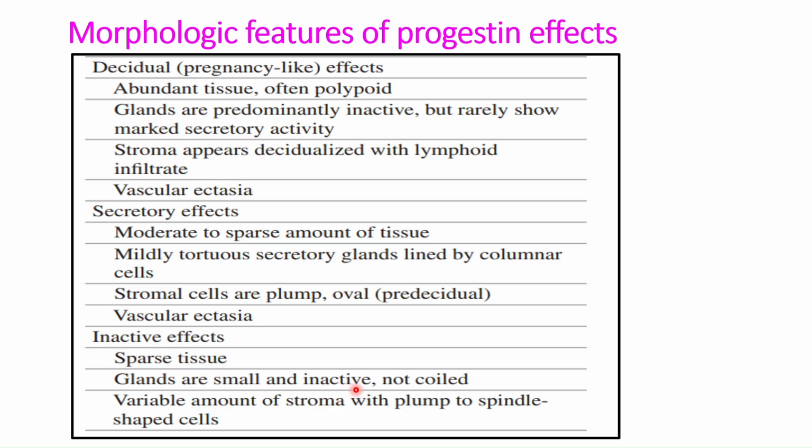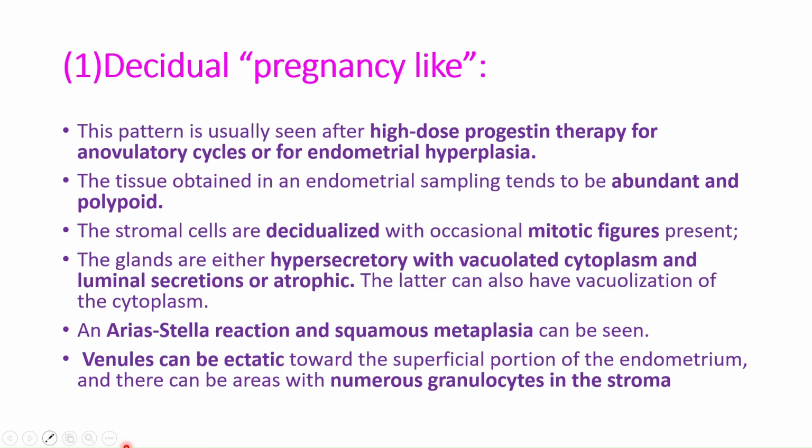and the inactive effect shows very little amount of tissue. Glands are small and inactive, not coiled. And here the stromal cells are plump to spindle shaped in nature.